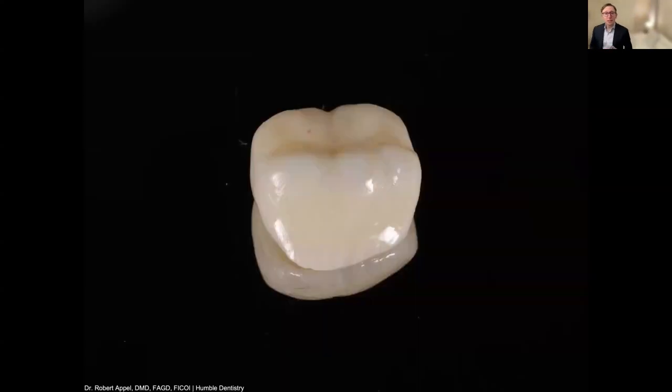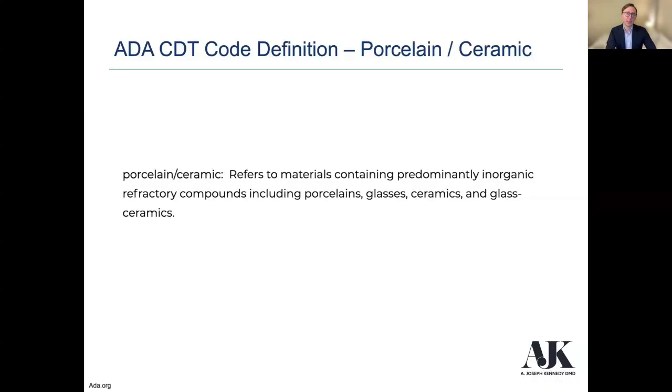So I think the most exciting thing about this is we can print crowns, right, and provisionals. Is this crown going to be able to withstand the force as a milled crown? I think that's something to be thinking about when we're doing this. Is this something we can use as a definitive crown? And hopefully in the next 10 or so minutes, we'll have an answer for you on that.